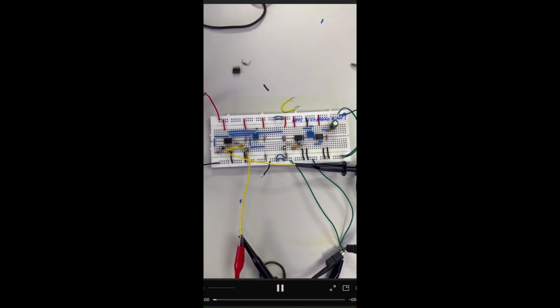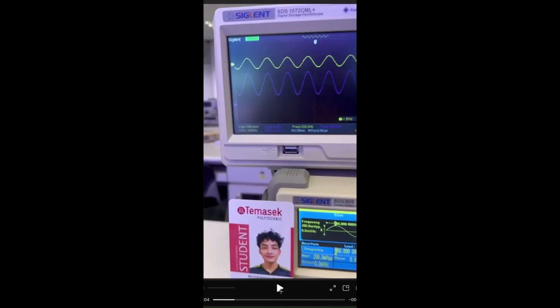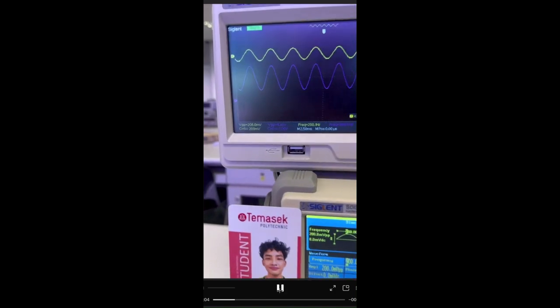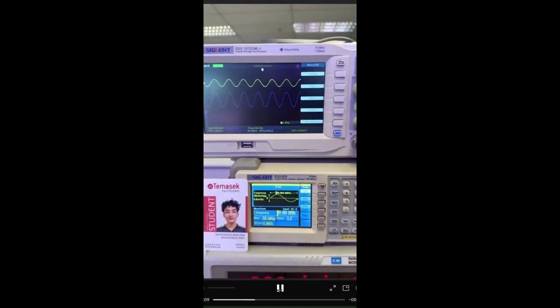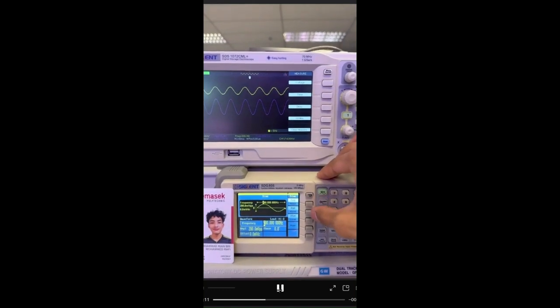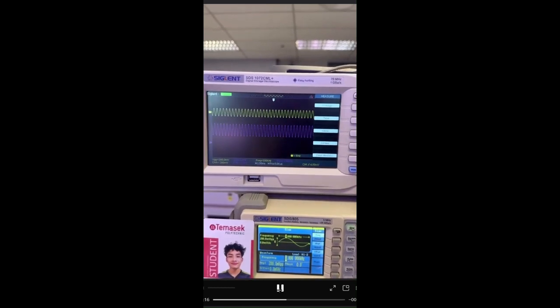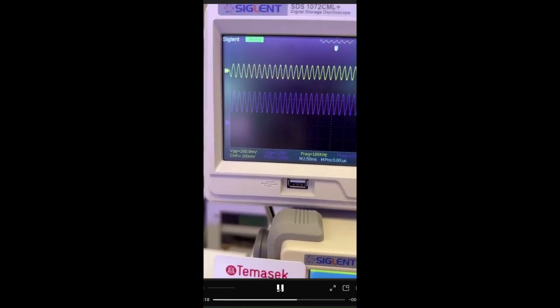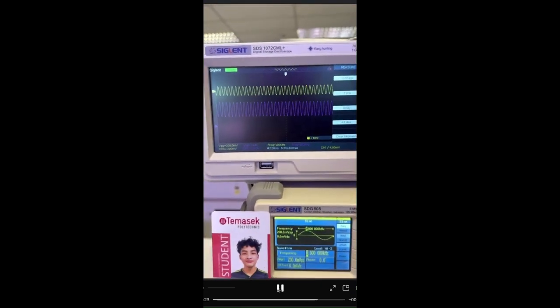So this is me measuring TP2, the output of the circuit. Over here is the graph, the sine wave on the oscilloscope with frequency 200 Hz, and the V peak to peak is 4.46 volts. Then afterwards, I changed the frequency to 1k Hz just to show how the output varies. So now the V peak to peak is 3.46 volts, approximately around there.